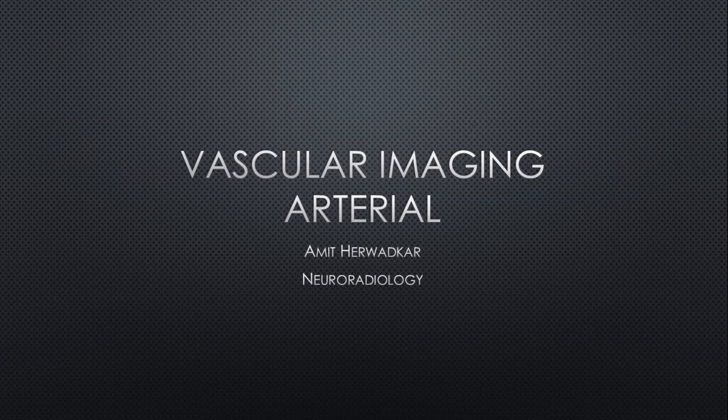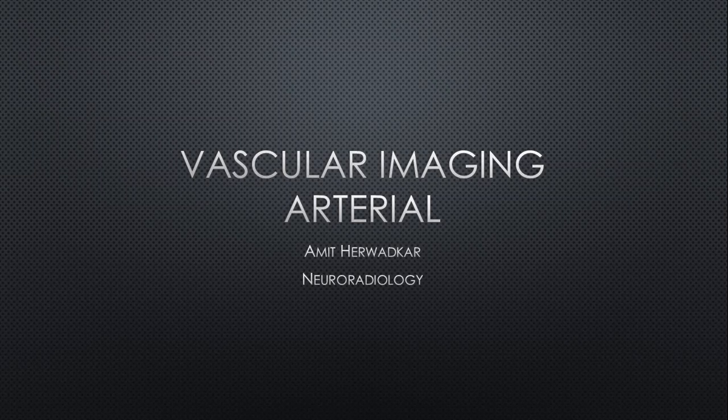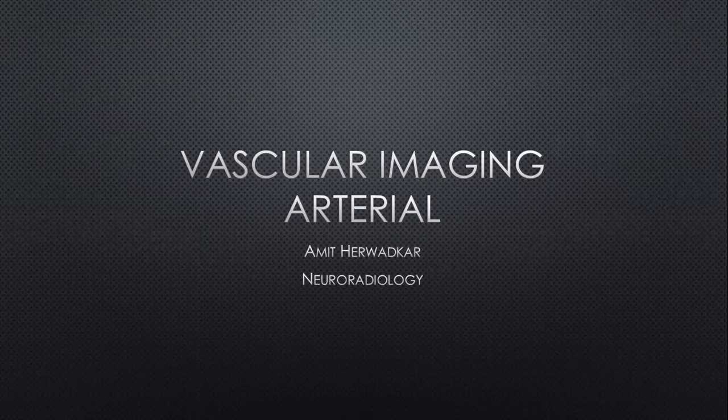Excellent. Okay, so we'll change our focus now from the neural structures. We are going to now start with vascular imaging, and today the emphasis is on the arterial imaging. And hopefully, what I wish to share is the fact that when we talk about arteries, vessels in general, we think about them as pipes communicating between the heart and the various organs.